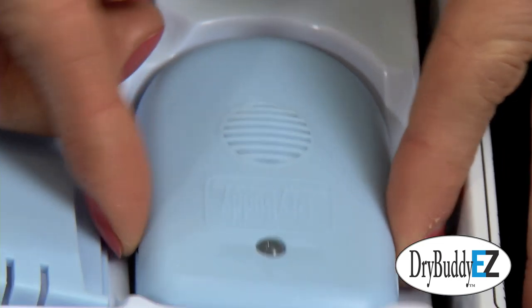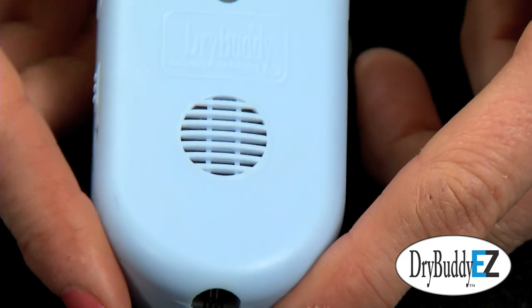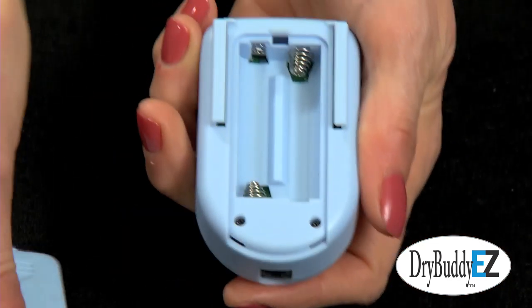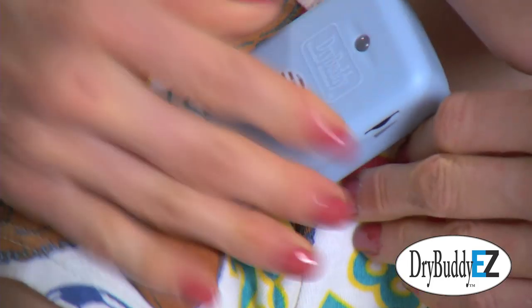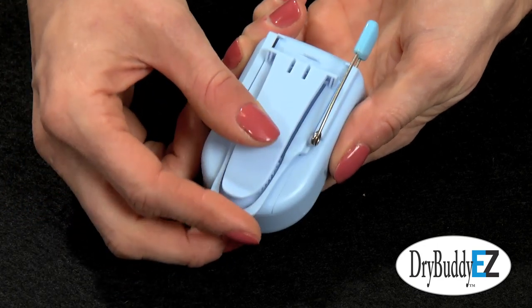I looked at the Dry Buddy EZ and found that it was a smart-looking alarm, unlike the boxy and bulky shapes of other alarms. It was also small, light, and could be attached to his nightshirt collar by a comfortable clip that held the alarm in place.